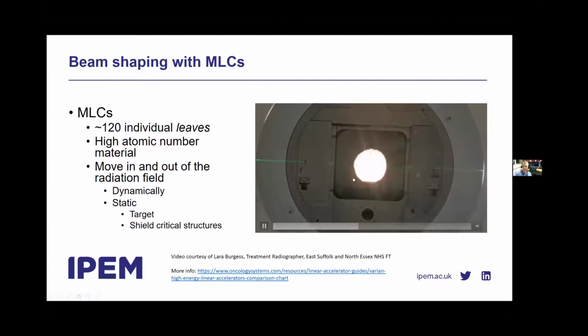So I'm hoping, because we are short pressed for time, I'm not going to be able to show this all the way to the end, but I'm hoping you can guess that the MLC apertures are going to spell out radiotherapy. So I thank you, Lara, for that video. It's rather lovely.